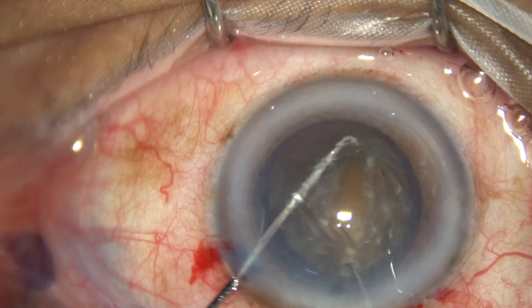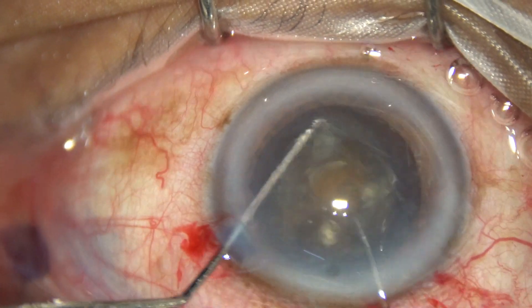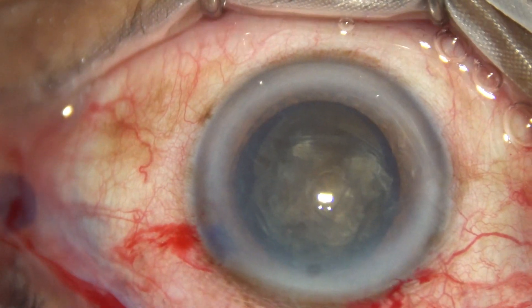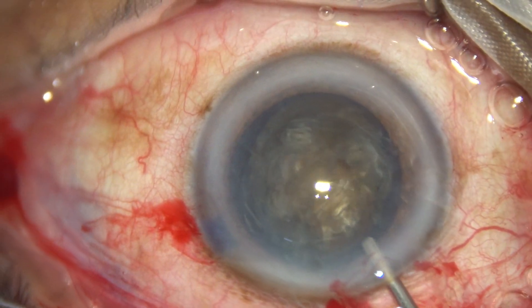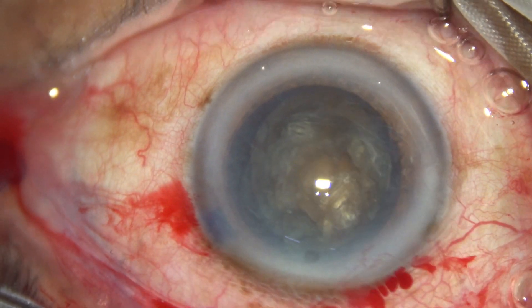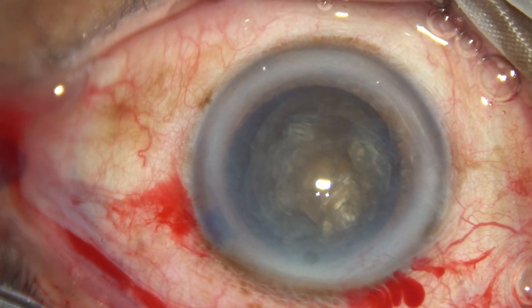I take two hooks and bimanually rotate the cataract. When we rotate the cataract bimanually in this way, the stress on the zonules is very minimal. Some more viscoelastic is added and then I enter the anterior chamber with the phaco handpiece.